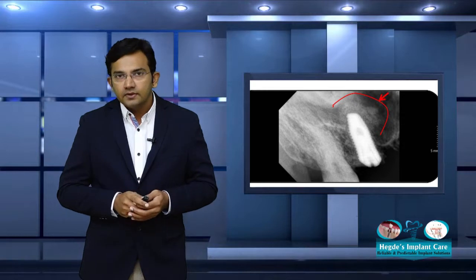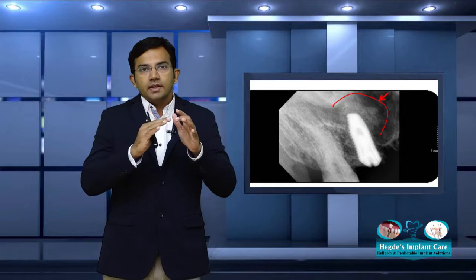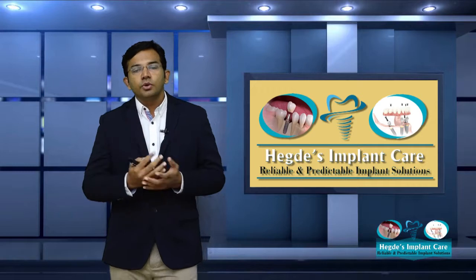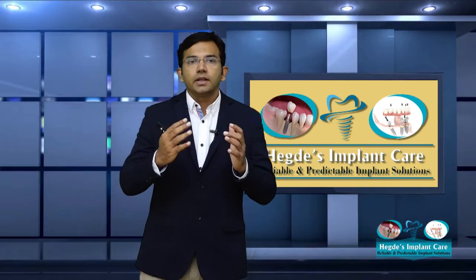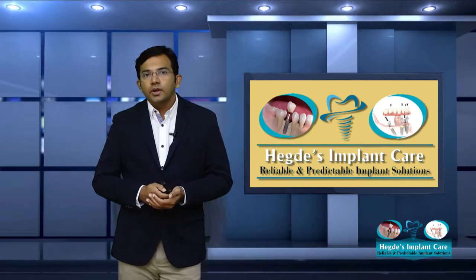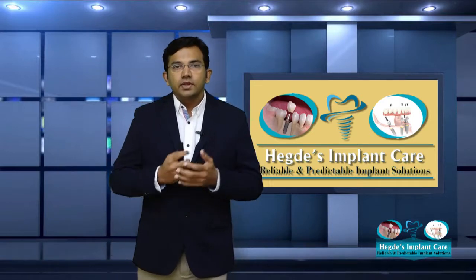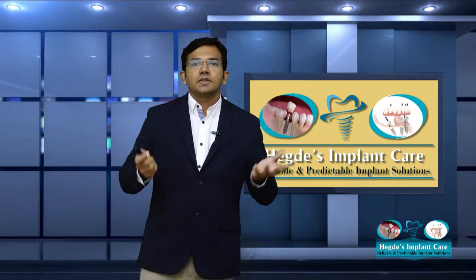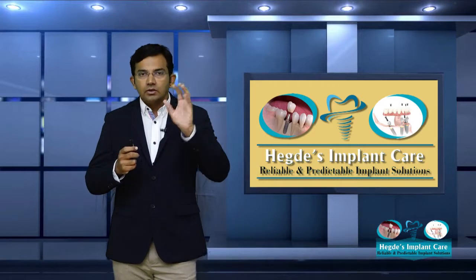The area that appears a little wide is the bone graft which is placed. The mark which I have shown you is the bone graft, and you can see a beautiful tenting in the X-ray, which means that the artificial bone is surrounding the implant. So basically, when there is no bone, we have created artificial bone in that area and placed the implant. Once we do this procedure, we generally have to wait about 5 to 6 months so that the bone formation takes place and it integrates with the implant. Once the integration is over, we can place the crown on the implant.